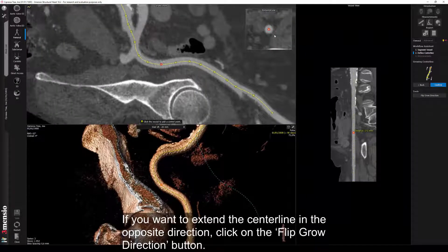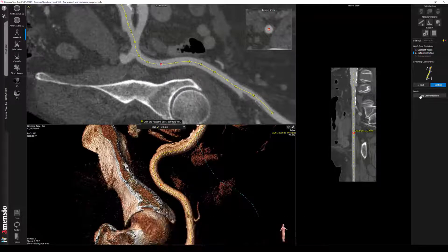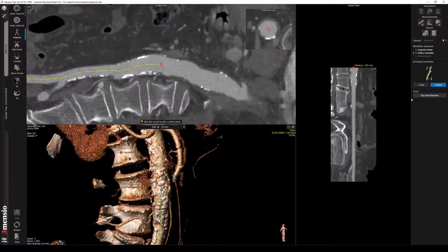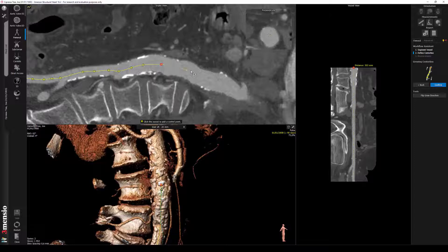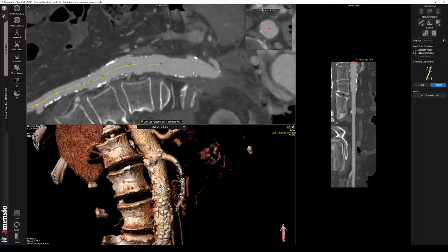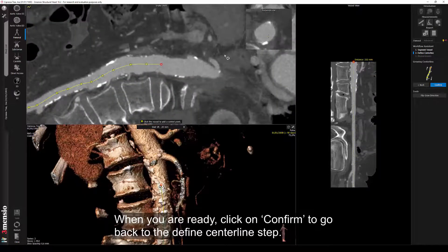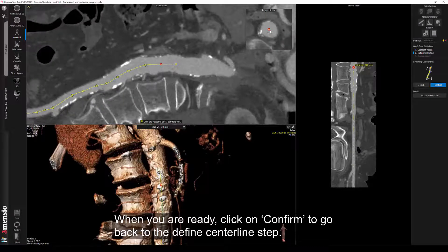If you want to extend the centerline in the opposite direction, click on the Flip Grow Direction button. When you are ready, click on Confirm to go back to the Define Centerline step.